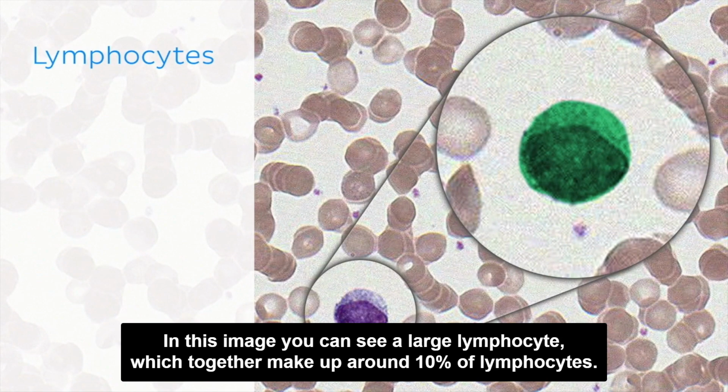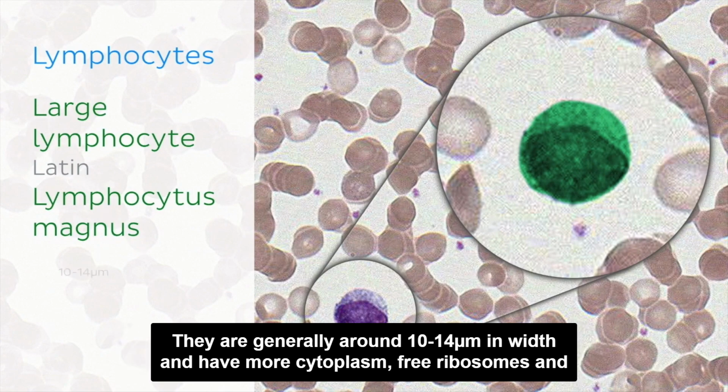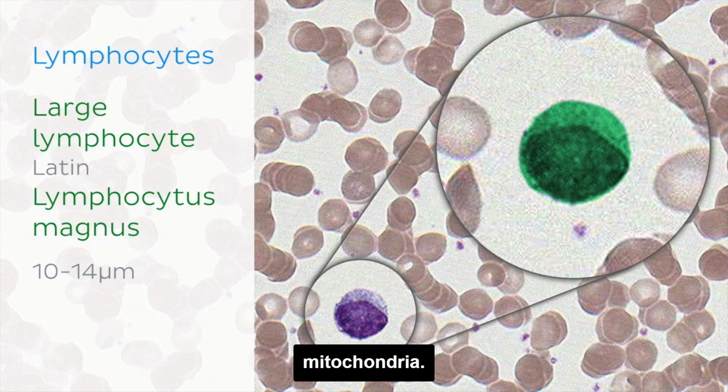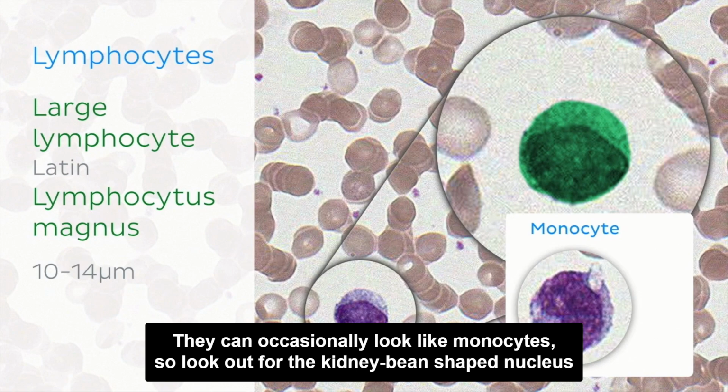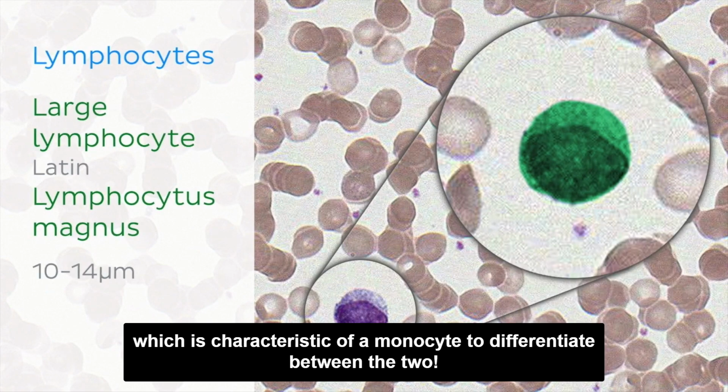In this image, you can see a large lymphocyte, which together make up around 10% of lymphocytes. They are generally around 10 to 14 micrometers in width and have more cytoplasm, free ribosomes, and mitochondria. They can occasionally look like monocytes, so look out for the kidney bean-shaped nucleus, which is characteristic of a monocyte, to differentiate between the two.